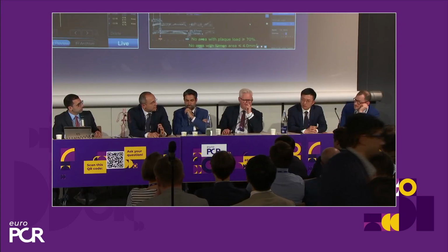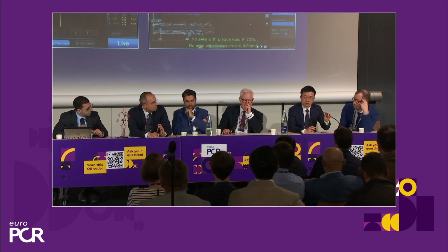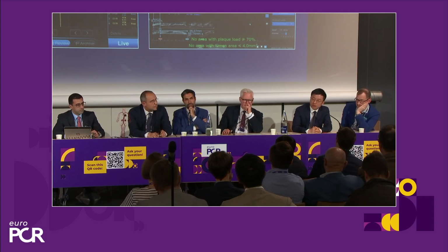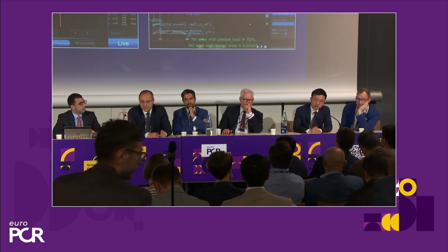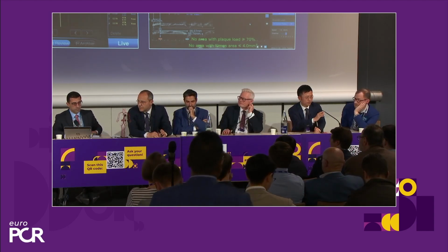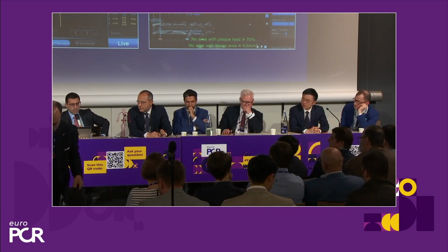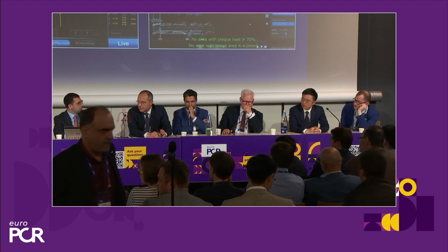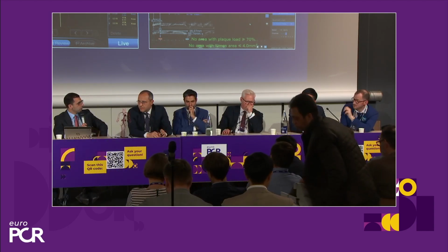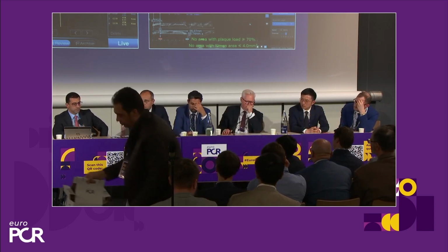So pressure microcatheter in small vessels, is it an issue? Any comment on this? So I think it's a low profile. I think it should be okay, even for the distal vessels. Like what's shown in this vessel, distal LAD, we still got quite accurate measurement. Any additional point from you, Salvatore? No, actually. So one other colleague is asking about resting index and FFR. Yeah. So which one, I mean, is the best one to use if both are comparable? Well, use the one you are most familiar with, I would say.